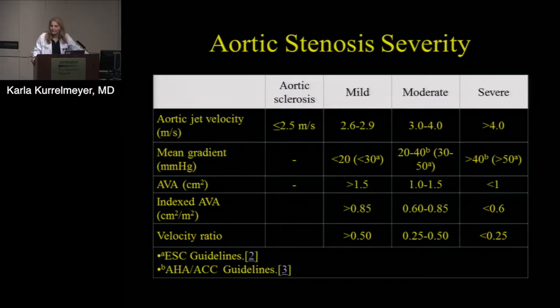One area where it's very helpful is low flow, low gradient, because you have low pressure gradient. Yes. I agree with you. I'll use that DVI, and it helps me figure out where I am. I agree, and it also helps on the other side when you have high flows and really high gradients, and the valve area is coming out somewhere in the moderate range, and you're really trying to sort it out. I use it there too, because frequently they're not really severe aortic stenosis. Frequently those patients are somewhere in the moderate or moderate to severe range.